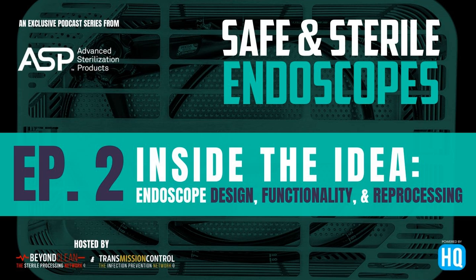Yeah, I think that's an interesting point in the context of the workflow conversations that we were just talking about. If this volume is going through sterile processing, they're much more comfortable and familiar with that next step into the sterilization cycle that you mentioned, just with the dryness concerns, packaging and whatnot. And they would be typically in the endo suite, even though there's sterile devices many times coming back into endoscopy from sterile processing with the accessories and whatnot. And so it's not that they're completely unfamiliar with what that looks like, but there's a level of change in the training, and then perhaps again in the workflow design layout, but definitely in the equipment that's being used, obviously.